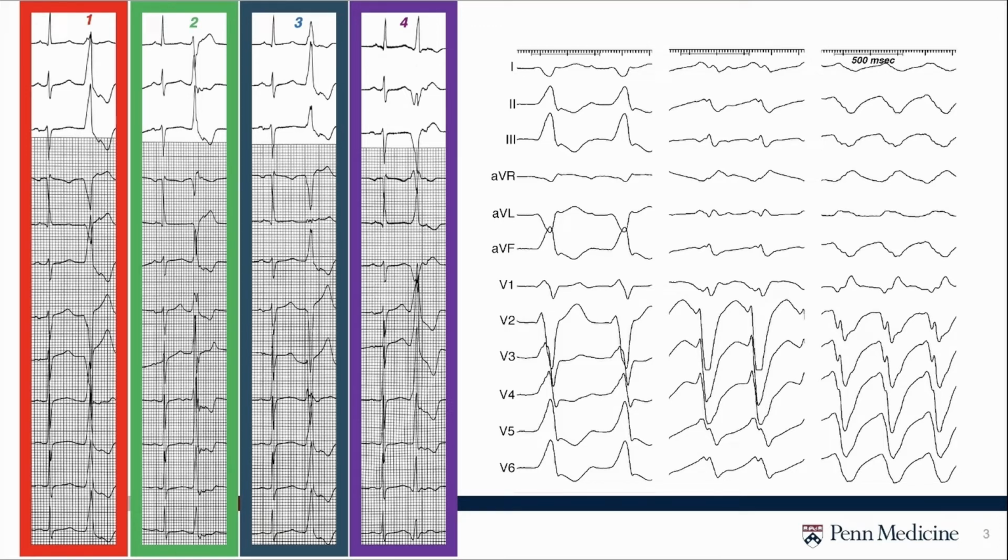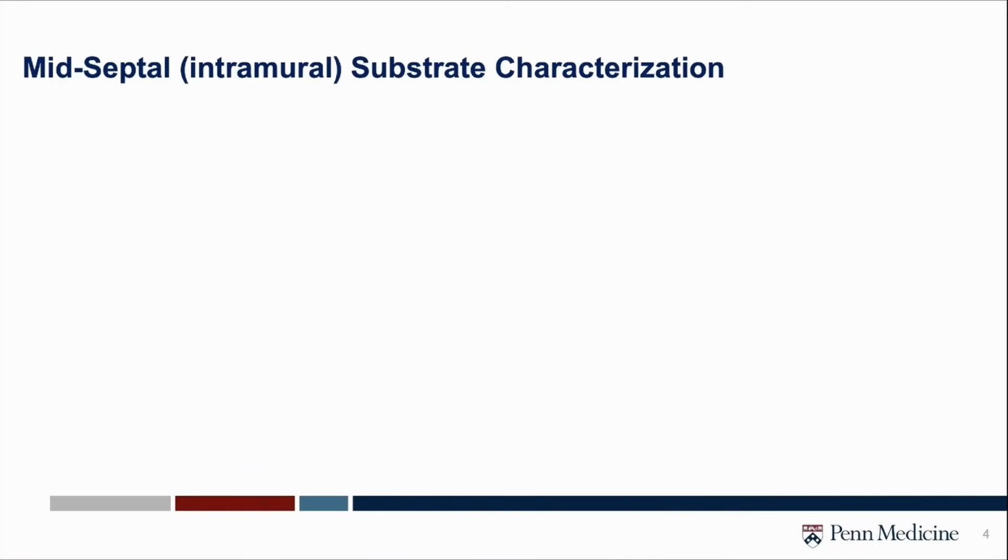So the clinical problem is going to be ventricular arrhythmias with septal ECG characteristics, and classically, you will find more than one morphology. It's a clue for septal VT. So the second step to identify septal substrate is the combination of imaging and EP study.